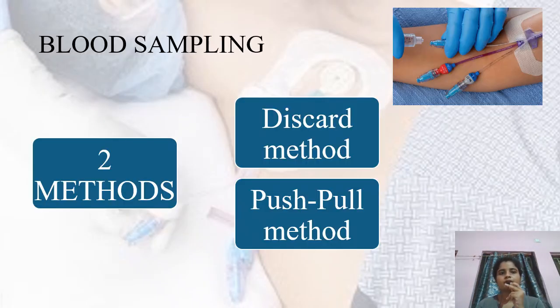Then coming to the next, that is blood sampling techniques. There are two methods of blood sampling technique. One is the discard method, another one is the push-pull method. Any method you can use.